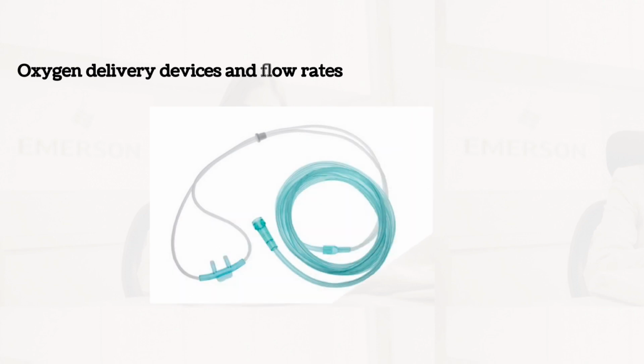Oxygen delivery devices and flow rates. A common question is, what percentage of oxygen does this device deliver at a given flow rate? Below is a quick reference guide, providing some approximate values for the various oxygen delivery devices and flow rates you'll come across in practice. Nasal cannulae.